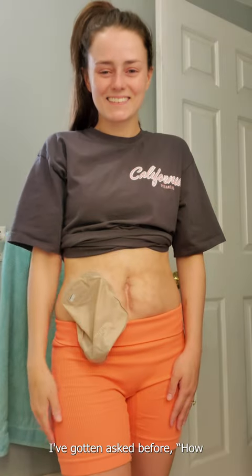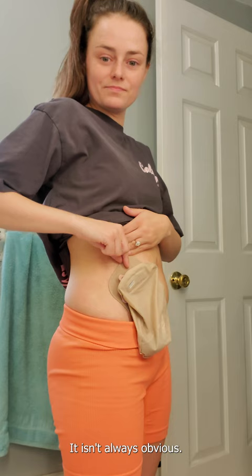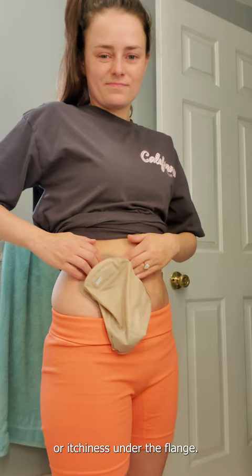Hey guys, I've gotten asked before: how do you know when to change your ostomy? It isn't always obvious. I'll start to feel lifting right around the stoma, or itchiness under the flange. That's how I know I've left it on too long.